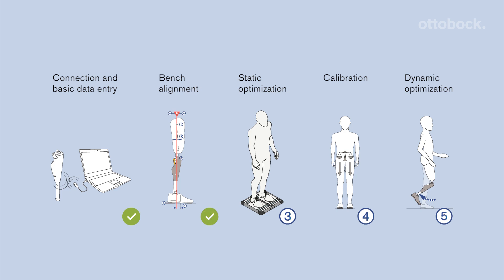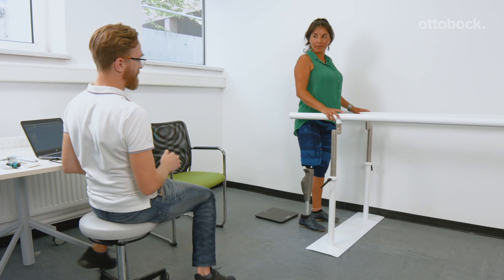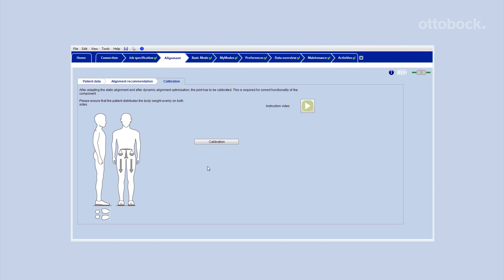After bench alignment and static optimization, it is necessary to calibrate the knee using C-Soft Plus. Do not forget to recalibrate after every change of alignment.